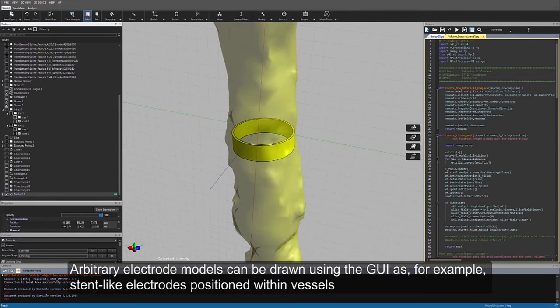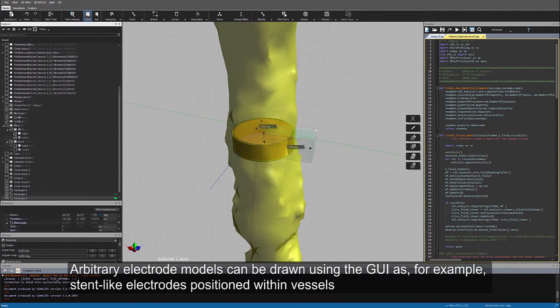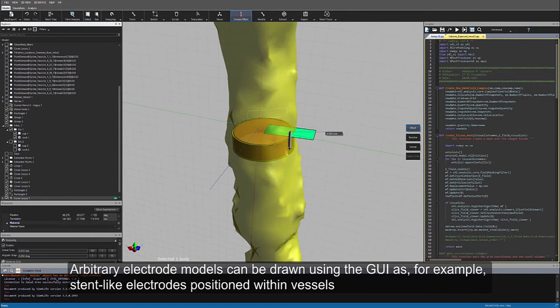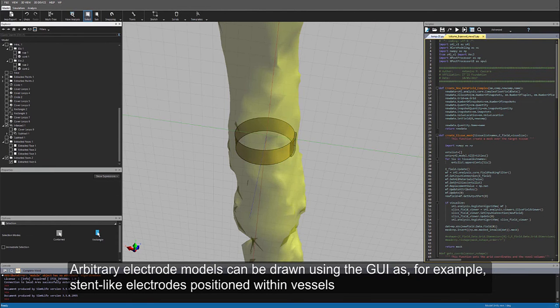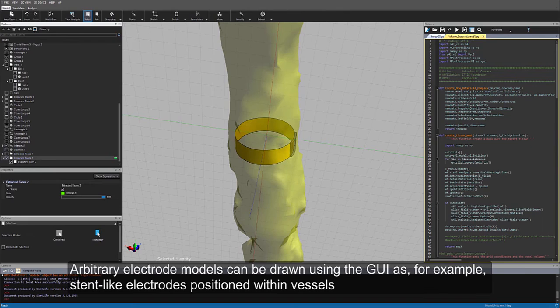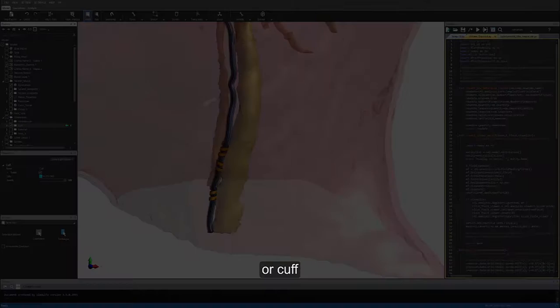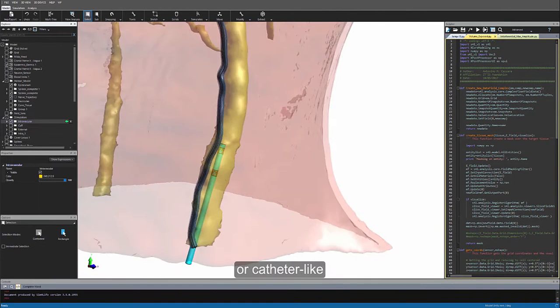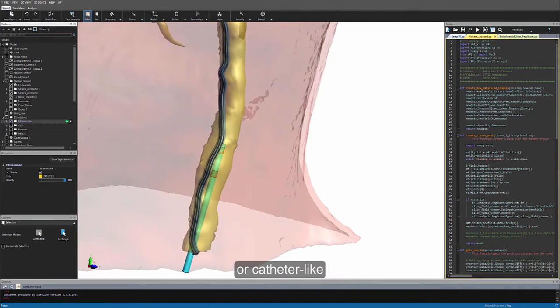Arbitrary electrode models can be drawn using the graphical user interface, as for example, stent-like electrodes positioned within vessels, or cuff, or catheter-like, or external electrodes.